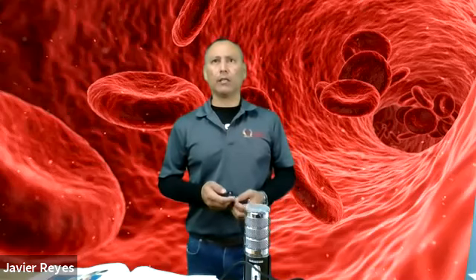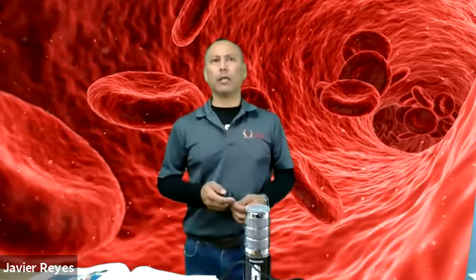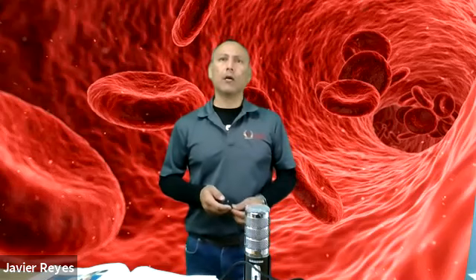So these hematocrit tubes are very useful for that. When you're trying to limit the amount of blood that you're going to be collecting, these disposable narrow bore plastic devices will be the best equipment for newborns or pediatrics when the infant already has low blood counts. So make sure you're familiar with it.